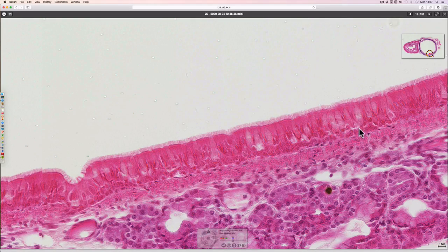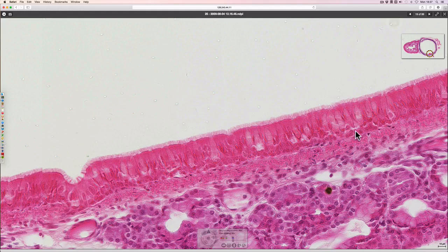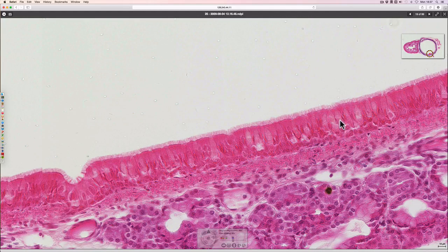Because of this, although it's a simple columnar epithelium, it looks quite disorganised, and people initially thought it might be stratified — i.e. layered. It's not. So it's called pseudostratified columnar ciliated epithelium.